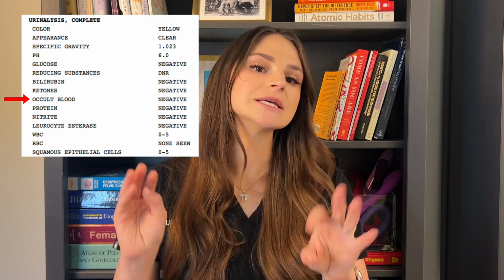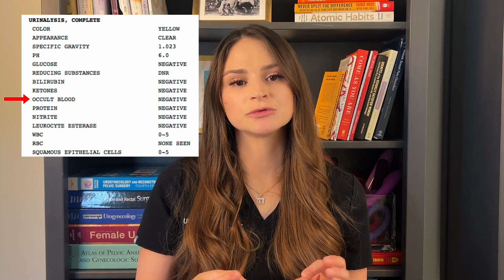Blood. And this is the most common concern that I hear as a urogynecologist. So this particular item, blood, doesn't really reflect the amount of red blood cells in your urine. And the reason why this is not specific is because it can detect any elements such as myoglobin, hemoglobin, that can be elevated just if you work out too hard. So if you see that positive, you need to look at the RBC.